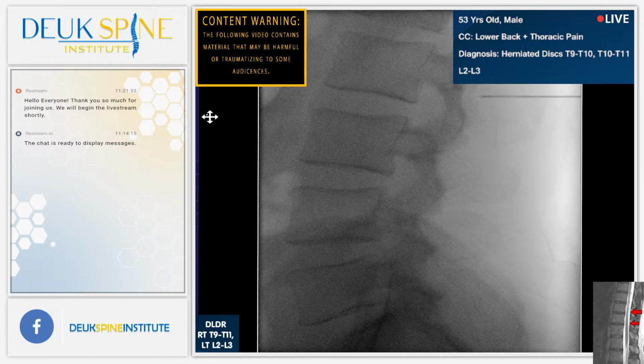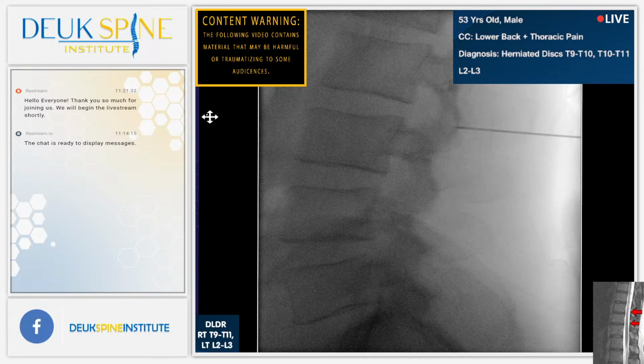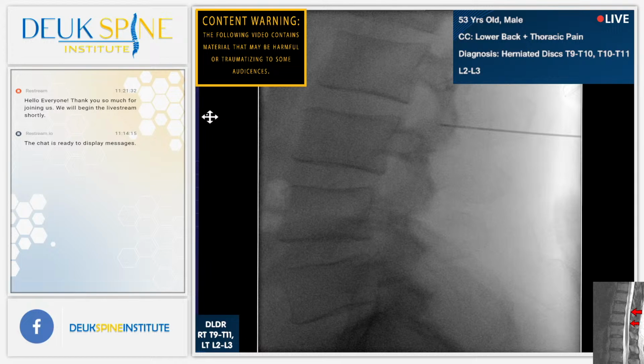5, 4, 3, 2, 2-3. We all see 2-3. Everyone agrees? Yes, sir. And shot. And his 2-3 is from the left. We all agree? Yes, sir. Left 2-3. All right. So there's the facet. He's got beautiful foramen. Look how nice the foramen is.